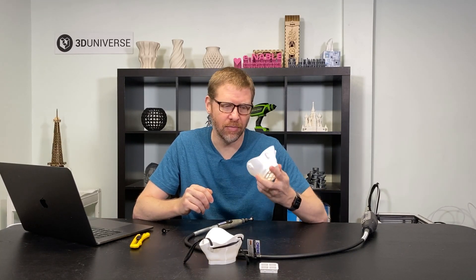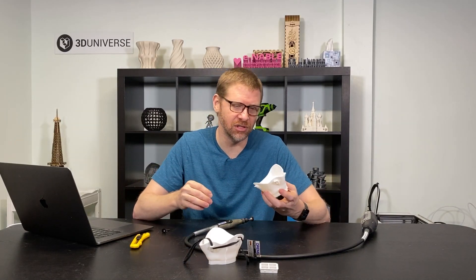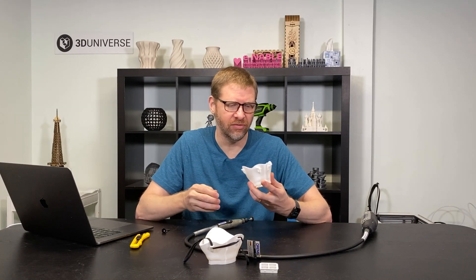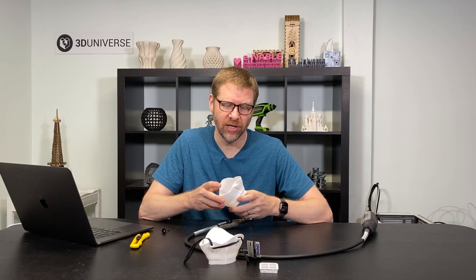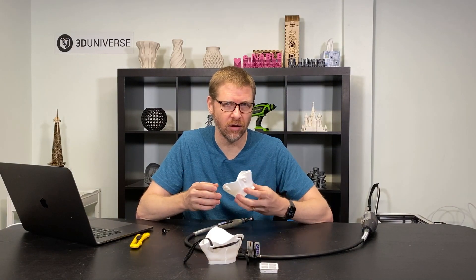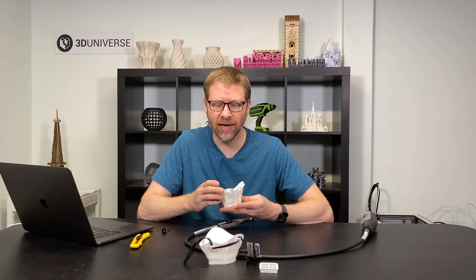That way, when you put the mask on, it's going to be a much more comfortable fit. As a side note, you'll notice I'm not wearing gloves right now. I find that it's easier to do my work on the mask and then go and sanitize the mask before giving it out to anyone. Once this is all finished, I'm going to wash this thoroughly with warm soapy water to make sure the mask is completely cleaned. From that point forward, I will wear gloves as I'm handling the mask, handling the filter material, putting things together, and sealing bags.